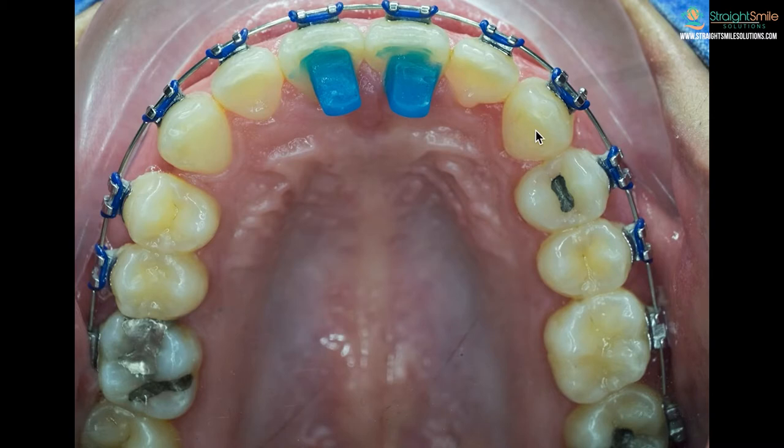So what are some of the reasons you might get bite bumps? The number one reason that people put them on is to prevent patients from biting down on their bottom brackets. Not all patients have that problem, but some do if their bite is a little bit deep. Do take a look at some of my other YouTube videos to learn more about deep bites and how they're corrected.